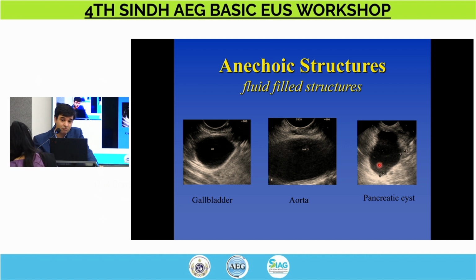Now, when we're talking about mud-type material, it's important to see gravitationally where this is sitting. The reason this becomes important sometimes is in the gallbladder, where you're seeing this mud-type material or something that forms a little ball-type structure, and you need to tell whether this is something that's adherent to the wall of the gallbladder or something that is mobile within. And so what you do is you can agitate the gallbladder, just move it around, and you start seeing this material rattle around the gallbladder, and that typically tells you it's more sludge than something like soft tissue growth within it.